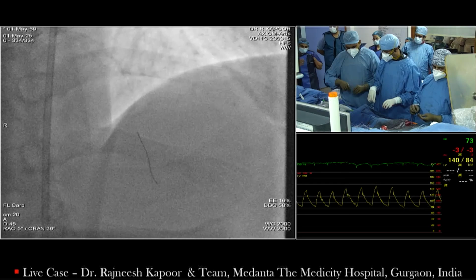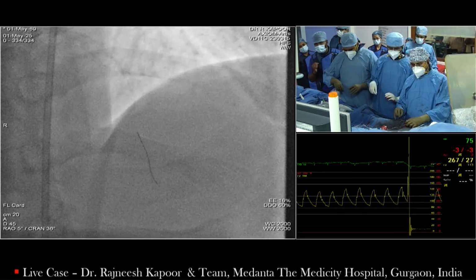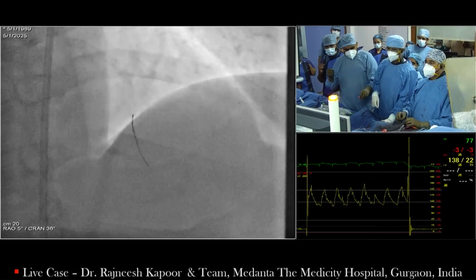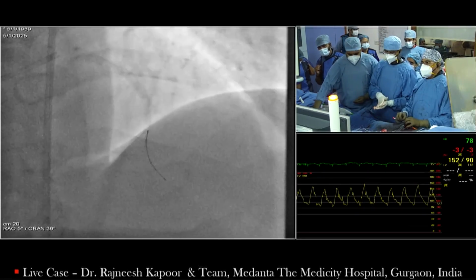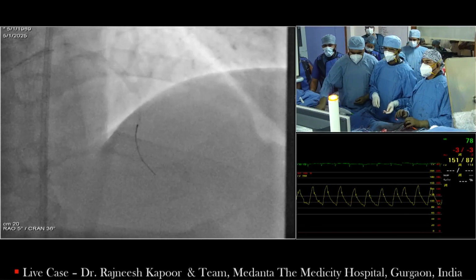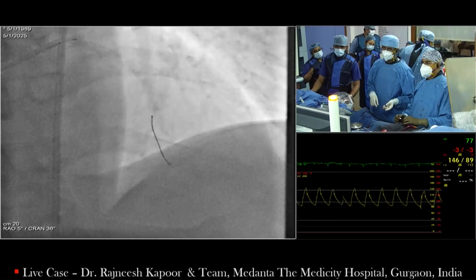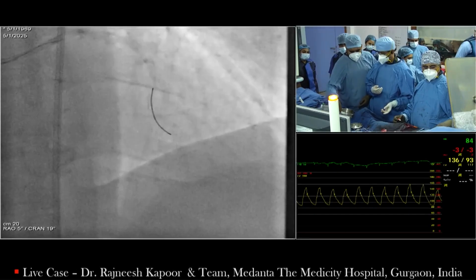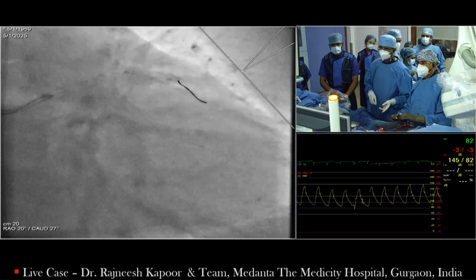Okay, so having done this, we are changing the wire back to the workhorse wire, and then hopefully after this we should have balloon movement much smoother, and that's what we are expecting. There is more sophisticated care needed after the procedure, so it still applies the concept that perhaps we are not supposed to do that, not because of the need for surgery, because likely the need for surgery is very low, but for the need of higher complexity care of the patient.